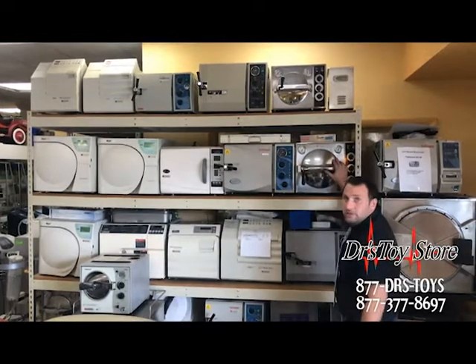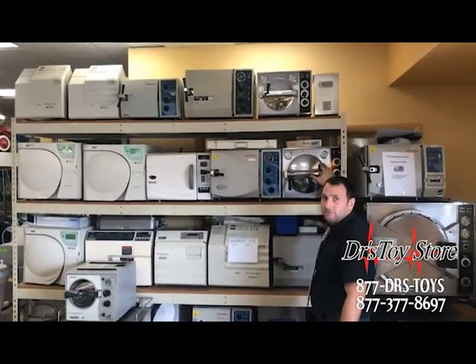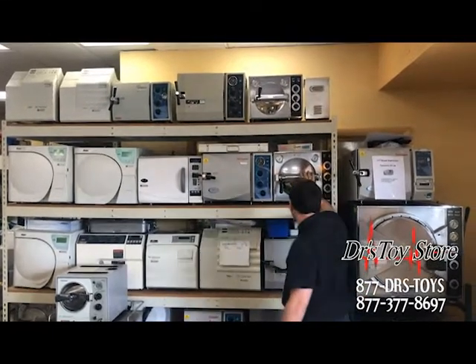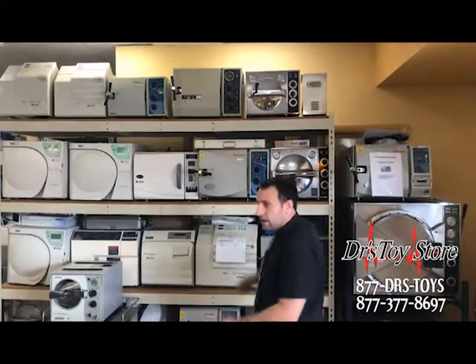We have nice Pelton Crane models which will last long enough that you could pass it on to your grandkid. The DCs are tried and ready. They have lasted over 50 years, most of these things. They will last forever.